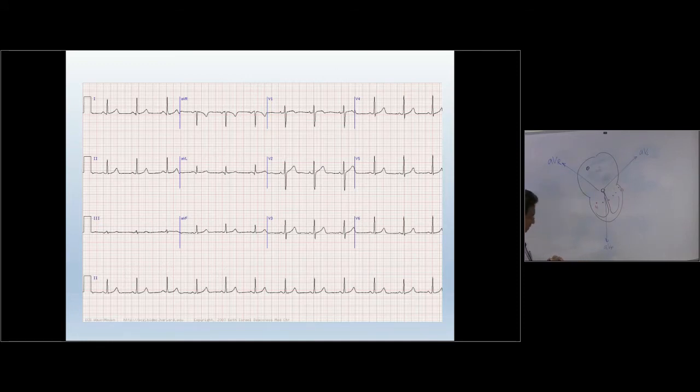All right. Then we need another 3 electrodes. That's actually electrical directions coming from the Einthoven triangle. All right. Now what the Einthoven triangle describes is the voltage differences and the directions of the electricity from right arm to left arm, then left arm to left leg, and right arm to left leg.